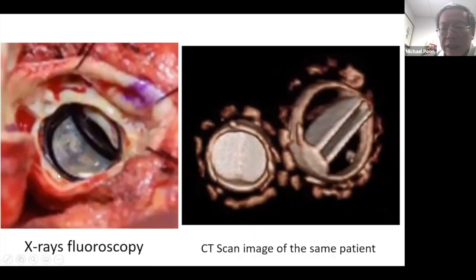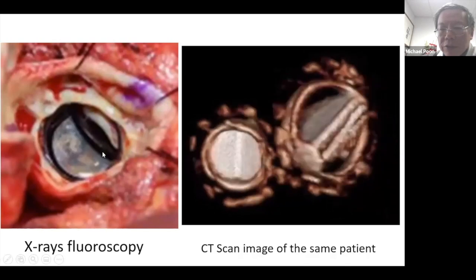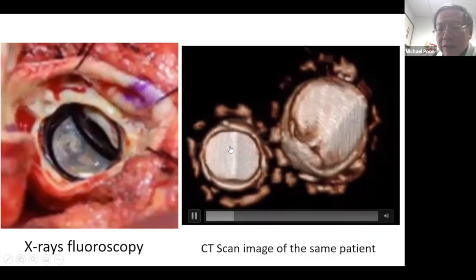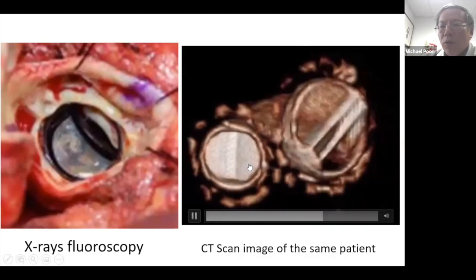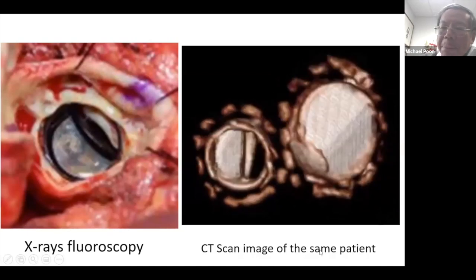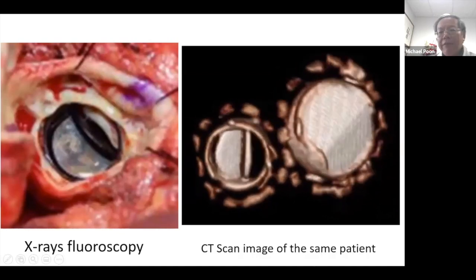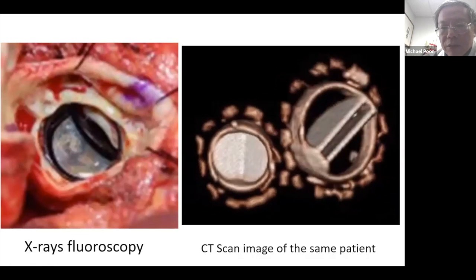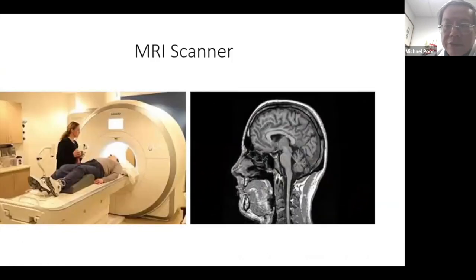And this is the inside of the operation, where the surgeon is looking at this valve that I was able to diagnose before the surgeon went in to remove the old mechanical valve and put in a new one. So you can see that having X-ray vision is very important, particularly when dealing with patients with complex medical problems. You really want to know what's going on before you do anything invasive.